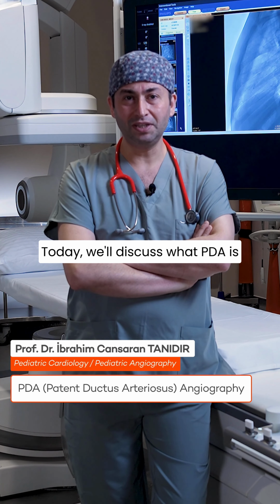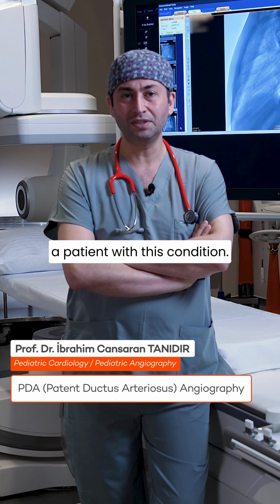Today, we'll discuss what PDA is and look at the angiography of a patient with this condition.